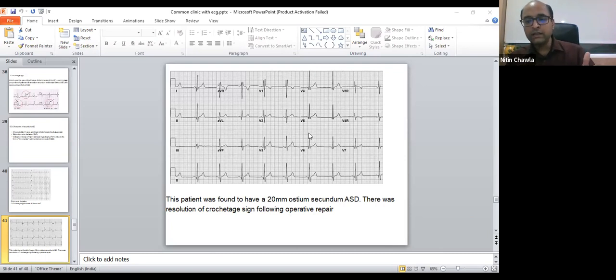So Brugada sign is one thing which everyone should be aware of, because if we know that, we are able to identify those who are prone to sudden cardiac arrest, and we can save some lives. With this message, and if there are no more questions, we will close this session.